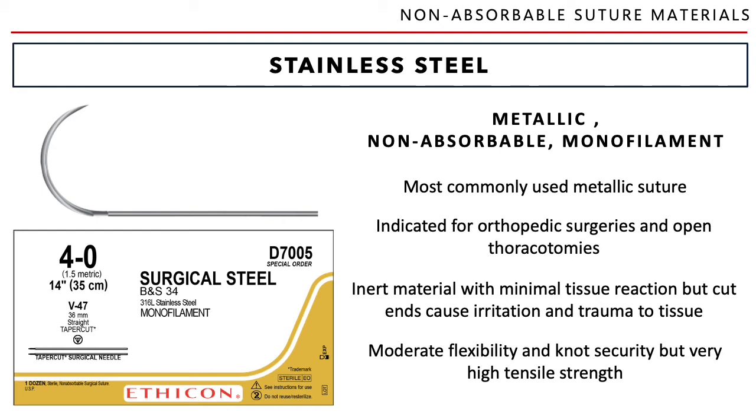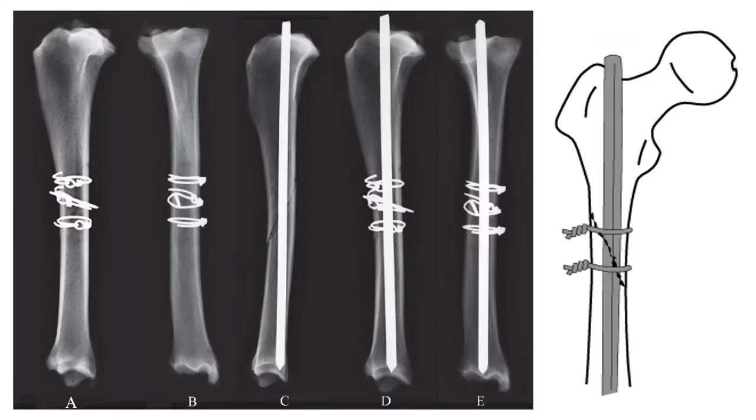What else? So, how do you use it for orthopedic surgeries? You could use that as a cerclage wire, CERCLAGE, cerclage, right? You're tying broken bones together. First, you put a pin inside, this big rod inside the intramedullary space of the bone, okay? And then, if it's unstable, you wrap the whole bone with wire, or basically stainless steel wires or stainless steel suture. Okay?